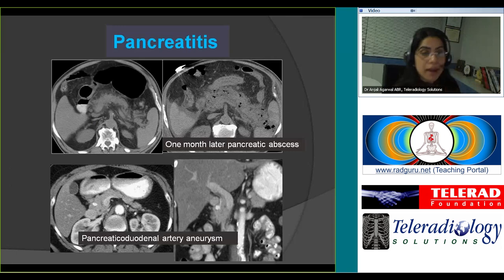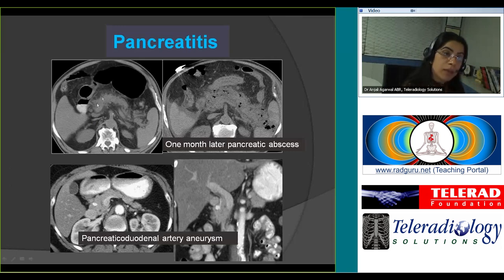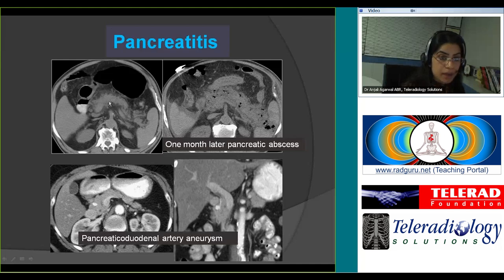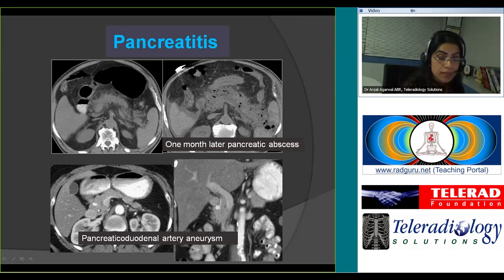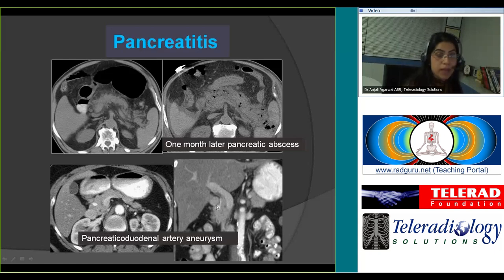Pancreatitis manifests as enlargement of the pancreas — diffuse or focal — with peripancreatic fat stranding and fluid in the retroperitoneum. This patient had pancreatitis and one month later developed a pancreatic abscess — notice multiple areas of necrosis, hypodense areas, and air loculi in the pancreas. Another complication of pancreatitis is formation of a splenic artery or pancreaticoduodenal artery aneurysm — this is an example of a pancreaticoduodenal artery aneurysm.